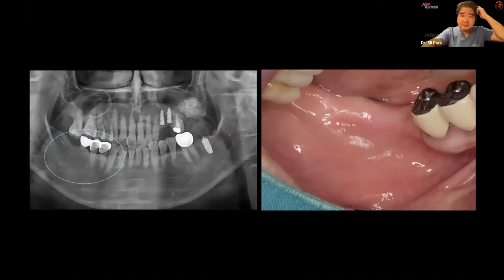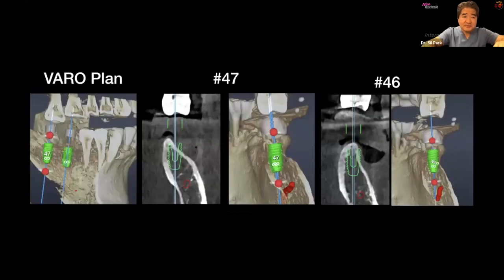And then the mandibular posterior case, as you can see over here, 2 implants are placed, planned to place, and also both implants have a buccal aspect with a big dehiscence, right? We know that from the very beginning. That means once we place the implant in the right position, there's going to be thread exposure, right?